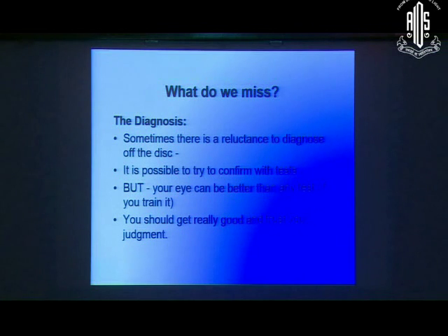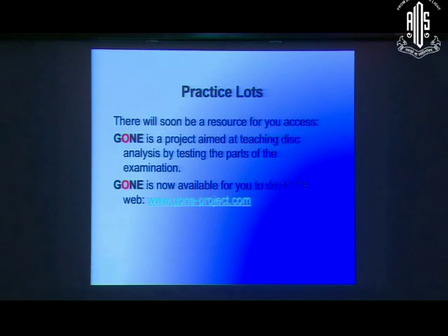So if you correlate multiple signs, it's easier, but picking up a single sign could be missed. Sometimes there is also a reluctance to diagnose glaucoma. Like in the last disc I showed after the hemorrhage, there are signs, but somehow you're not sure, and you want to confirm with other modalities. So I think clinically, if you suspect glaucoma, once you have gone through some practice sessions and you have been looking at these discs on a regular basis, it may not be very difficult. So the confidence level needs to be built up, and then subsequently one can always investigate these cases.